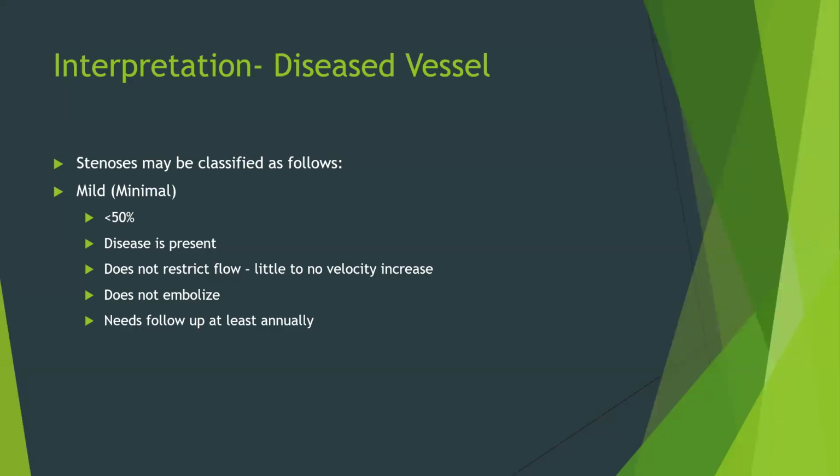So it doesn't mean that we don't follow up on these patients, but suggestive of following up annually, because plaque can build on itself and eventually it can create a hemodynamically significant stenosis. So still needs to be followed up on if we have mild or minimal disease, okay? So important in our exams, and important when we're putting in our worksheets, whether it's less than 50% or whether it's 0%. If it's 0% and there's no plaque, there's probably no need to follow up. But if you're seeing plaque, that's still important to note.